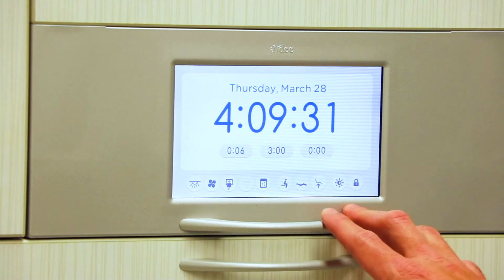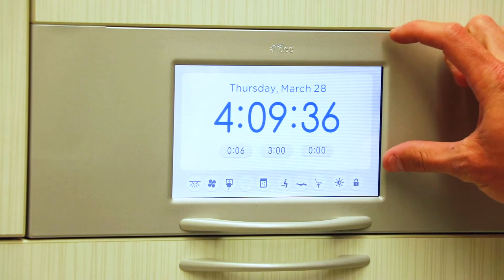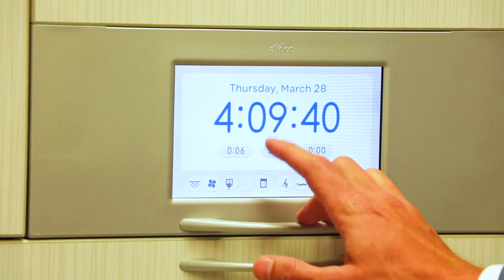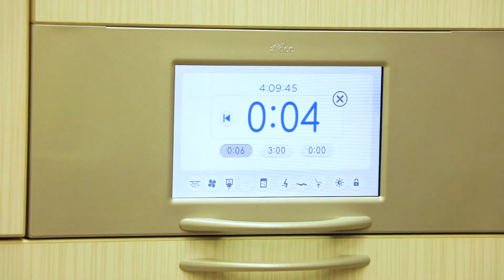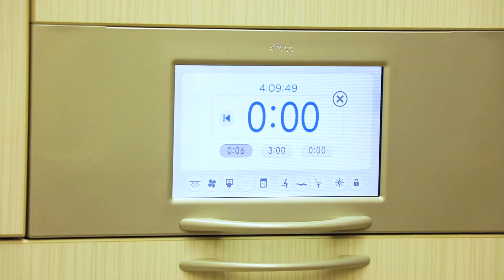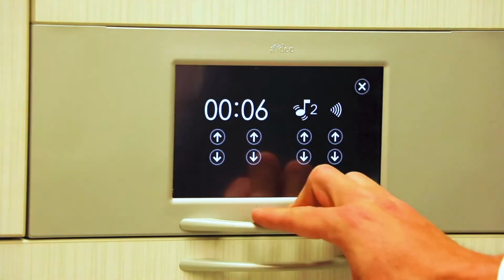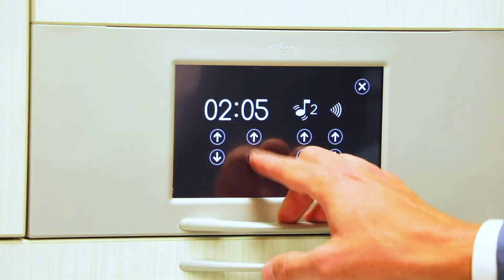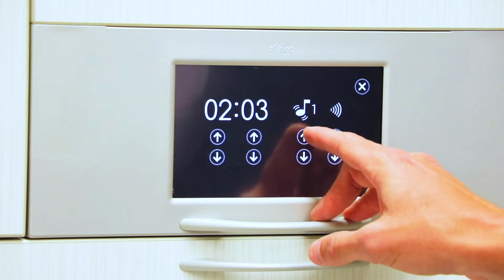So as we move up from the buttons on the bottom portion of our control center, we then get into basically our clock and timer. And the way to adjust these is if we actually want to set a timer for 6 seconds, we can hit that button and that will run that 6-second countdown timer for us. You'll hear a chime, and that chime can actually be changed if you hold that button down. You can increase or decrease the time needed. As far as if you were setting up any materials or anything like that, you can change and cycle through the chimes.